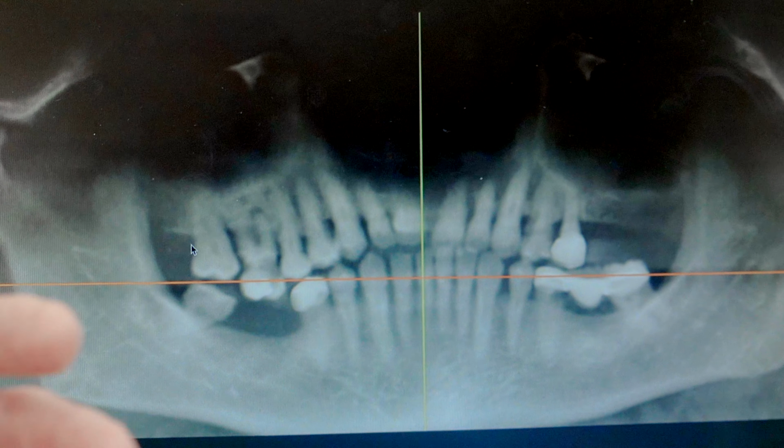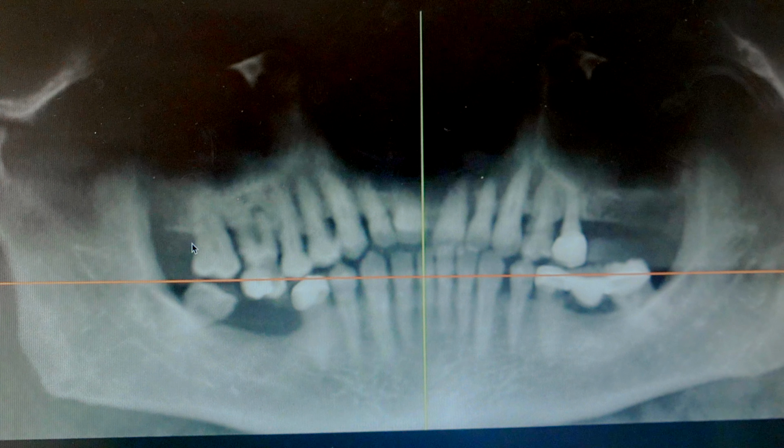And so we go ahead and get the patient ready for surgery, scheduled to have his teeth taken out. So we schedule the surgery, get everything ready, do the pre-op, do his EKG and his labs, and get everything ready. So day of surgery, we're good to go. We have all of our temporaries ready and we know how we're going to execute on this case, where the implants are going. We know everything.